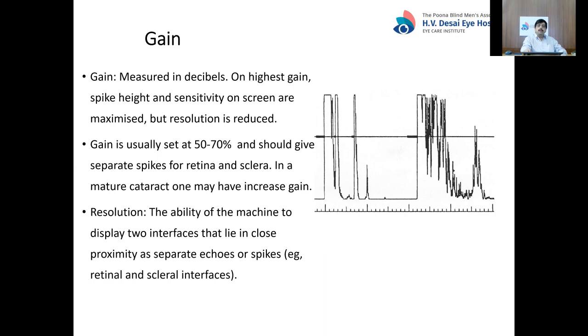If, after adjusting the gain settings, you still do not get a scleral spike, then probably your beam is focused on the optic nerve, where there is no sclera.